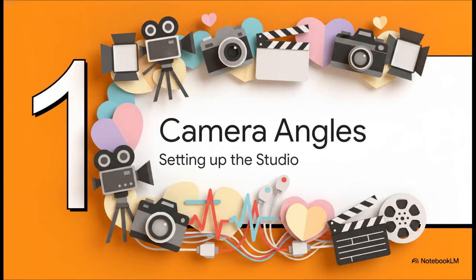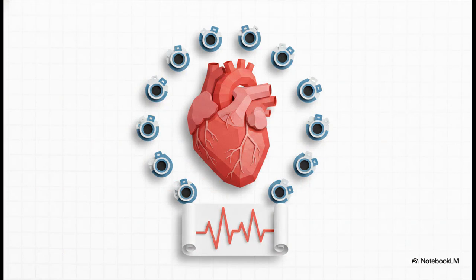All right, section 1, camera angles of the heart, setting up the studio. Now, capturing a complex 3D object like the human heart, we need a lot of perspectives for that. And that's exactly where the standard 12-lead ECG comes in. It gives us this really comprehensive 3D view of both atrial and ventricular depolarization and repolarization. Think about the challenge here for a second. The heart is 3D, but the readout we're ultimately holding is a flat 2D piece of paper. We literally need all 12 of these distinct camera angles working together so we can reconstruct that full volumetric picture in our heads.